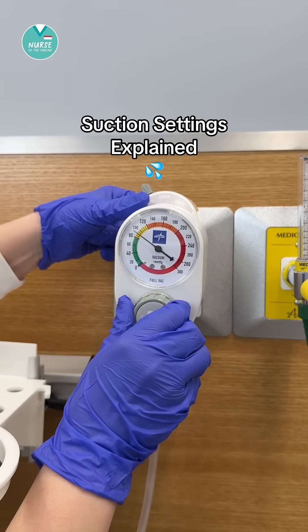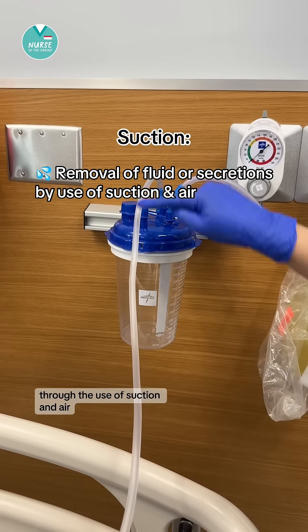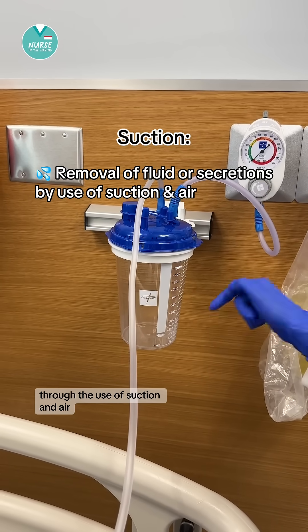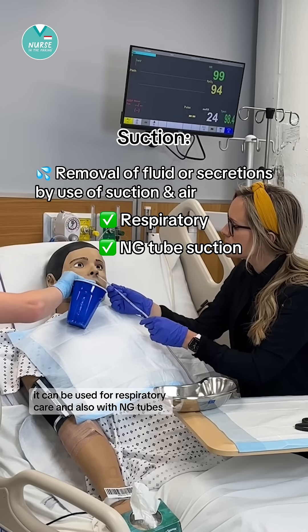Let's talk about suction settings. Suction is when fluids or secretions are removed through the use of suction and air. It can be used for respiratory care and also with NG tubes.